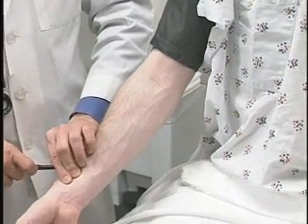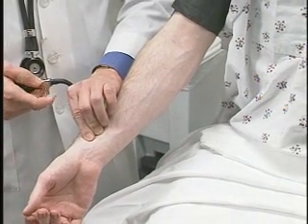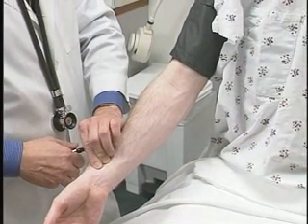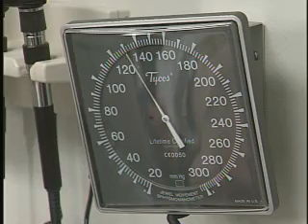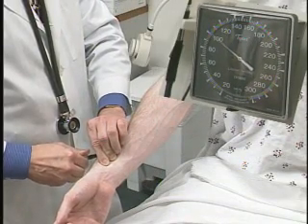Simply identify the radial pulse, tighten up the valve in the blood pressure cuff, and by watching the sphygmomanometer, I'm going to determine when I stop feeling the radial pulse and blow up the cuff approximately 20 beyond that. And I felt the pulse disappear about 110.